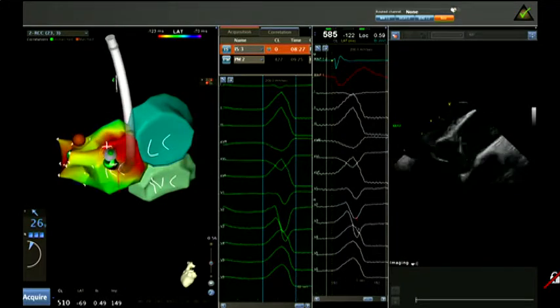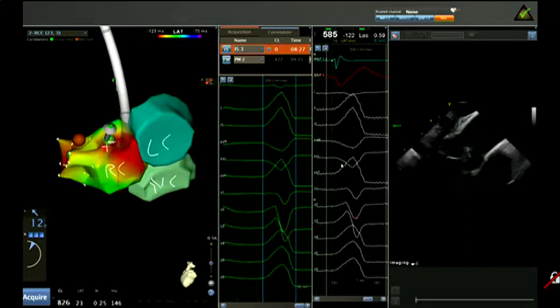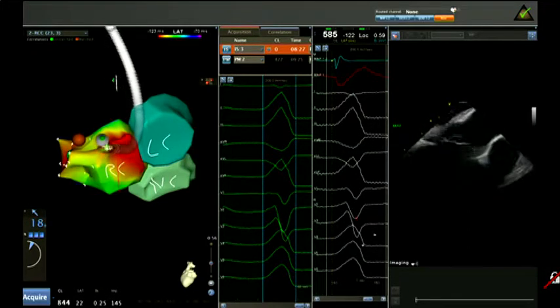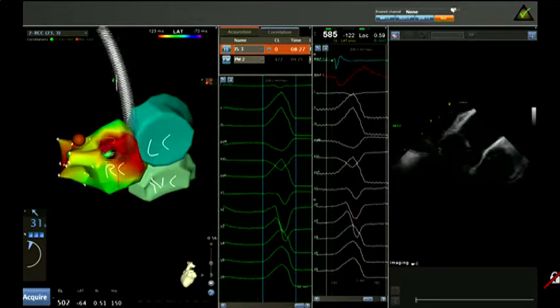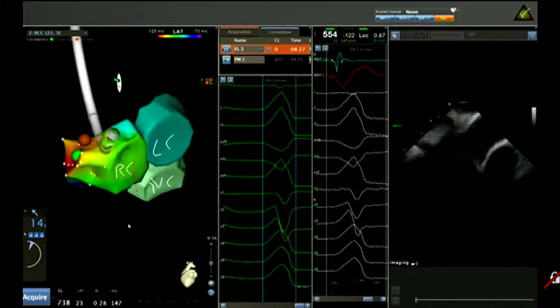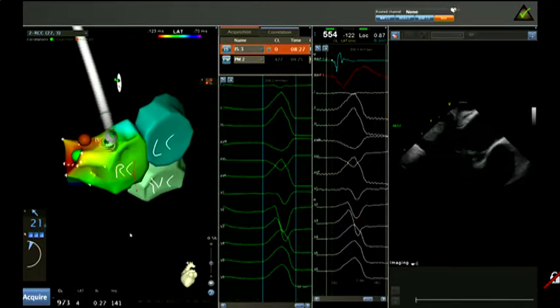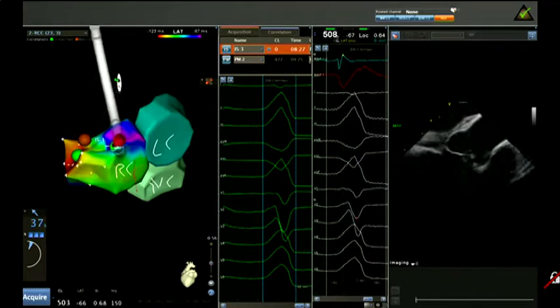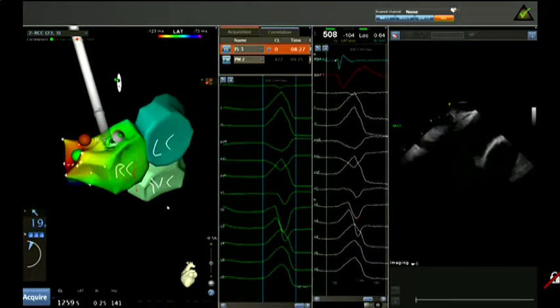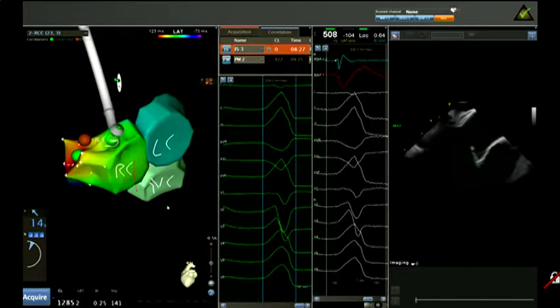It's the concept of coronary arteriography. If there is an infarction, you want to start seeing which is the culprit. You don't take more than 10 minutes in doing a rough map of the right side. It's a comparison: the right cusp against the septal aspect of the pulmonary artery. Yeah, that's a comment.